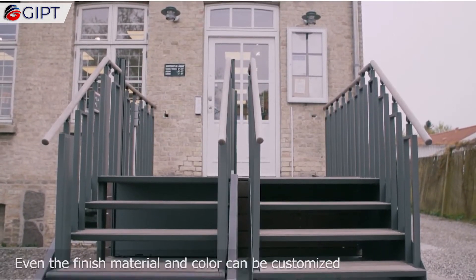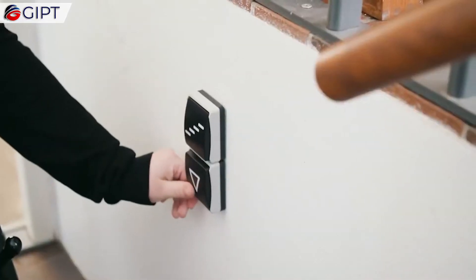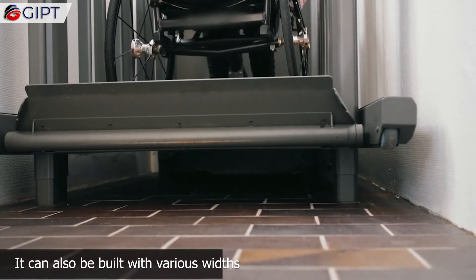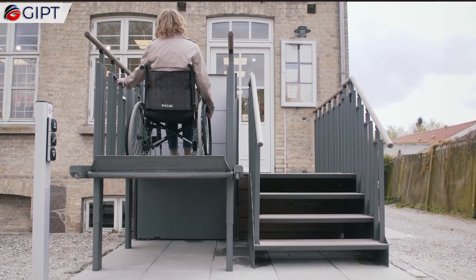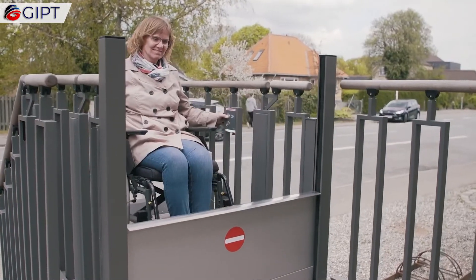Even the finish material and color can be customized. The configurations range from a two-step model to six-step models. It can also be built with various widths. The Flex Step has a lifting capacity of 400 kilograms.